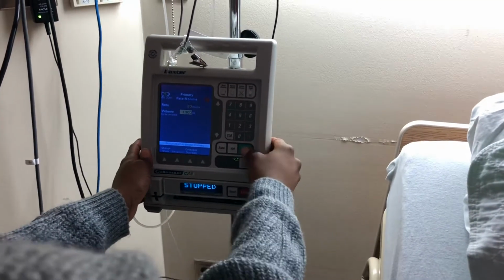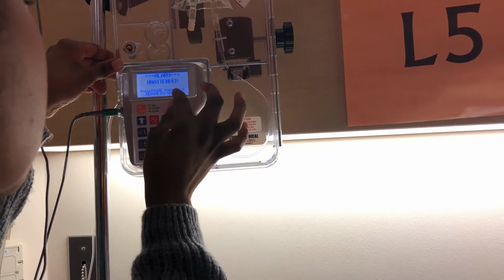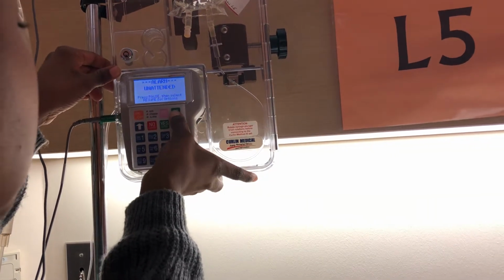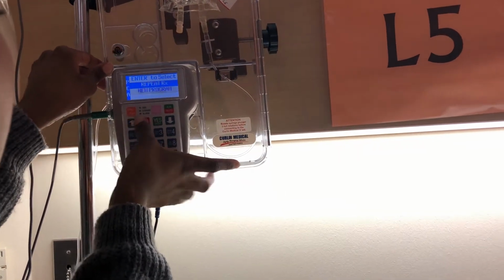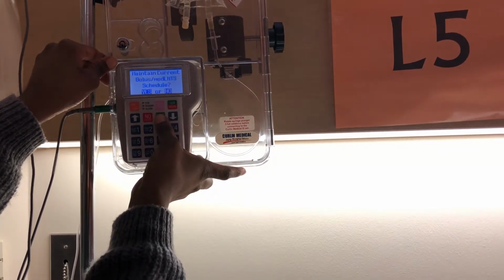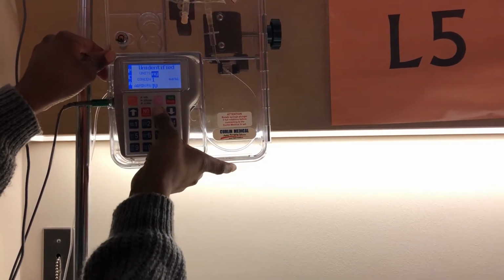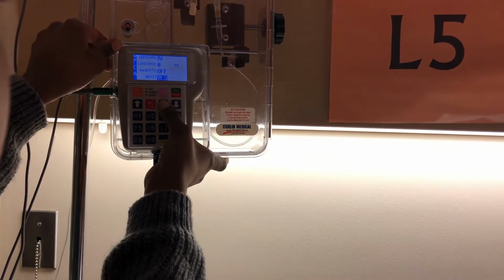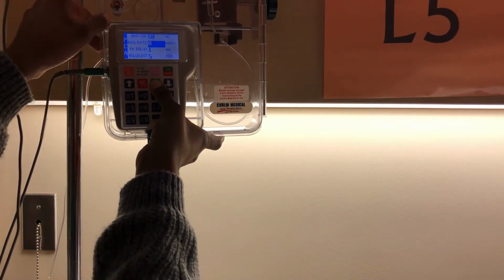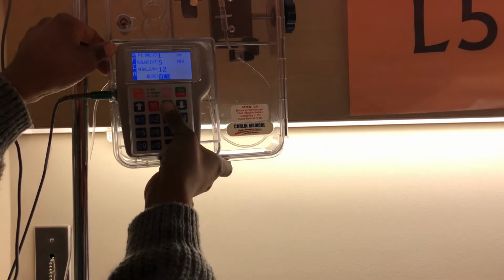Confirm primary, press start. And then I will come here and press pause and select. Press pause and then go up, repeat, yes, to maintain current schedule. So we just go over this: 1 milligram IV 0. Next, yes, 50 mils, basal 0, patient bolus 1, 5 minutes 12, done, yes.